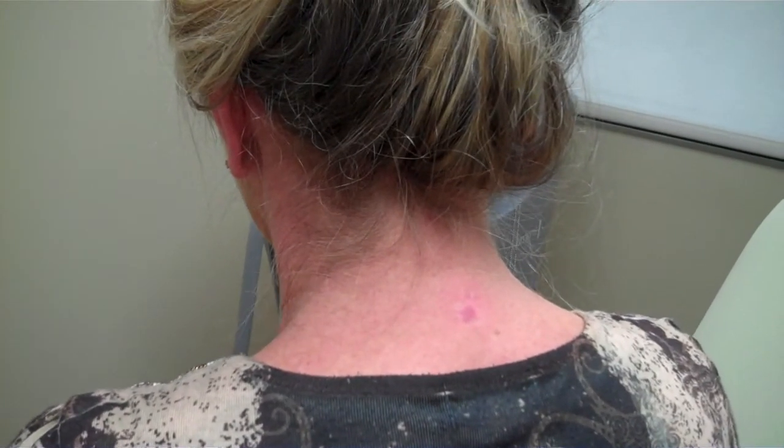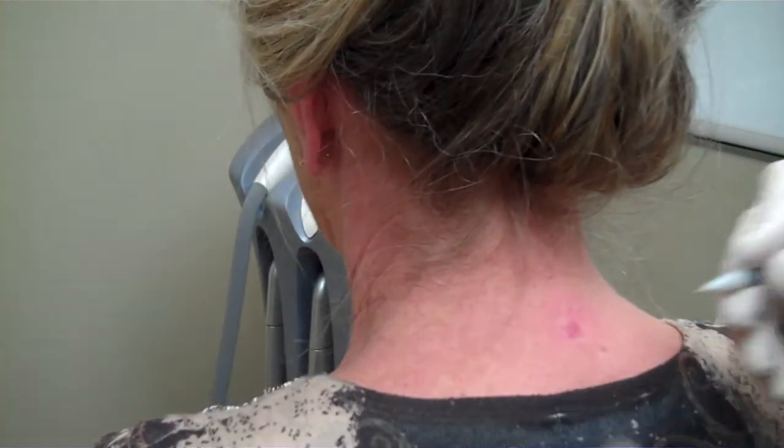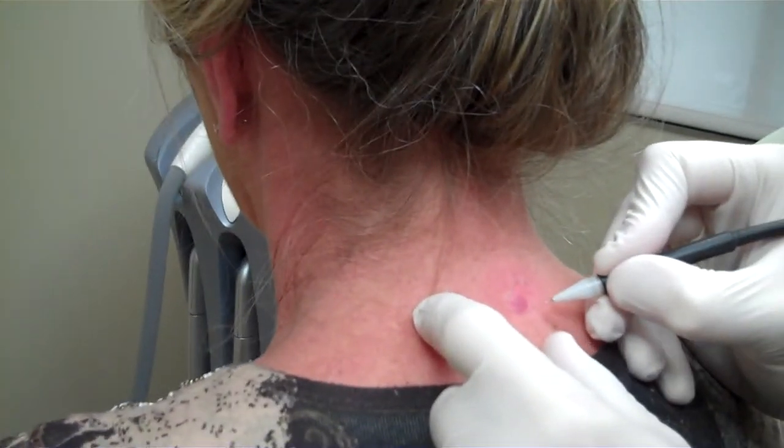She's got a pretty impressive before and after picture. She's really happy with it. She feels like she can wear necklaces again and so you can see this is not too difficult of a treatment to get through.